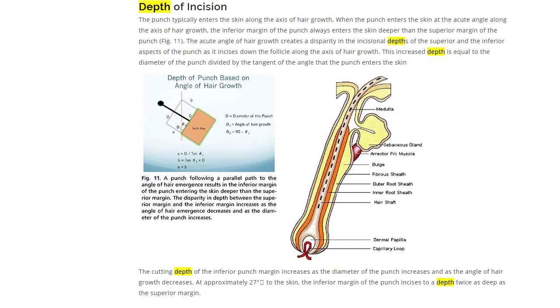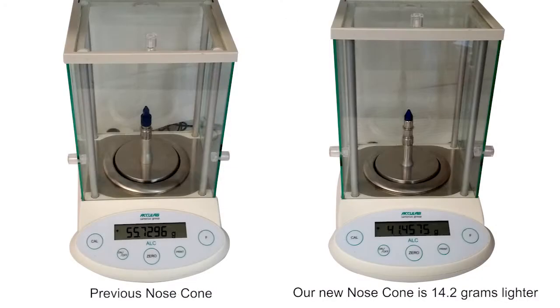Our new nose cone is 14 grams lighter than our previous version, and that's huge. It really reduces your fatigue.